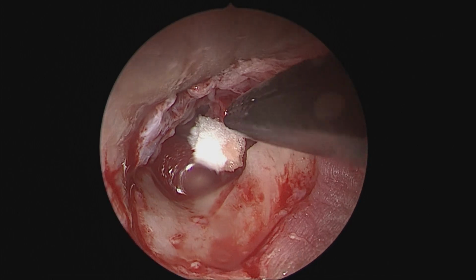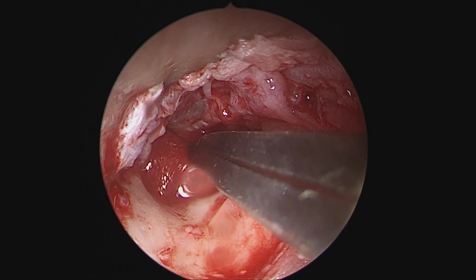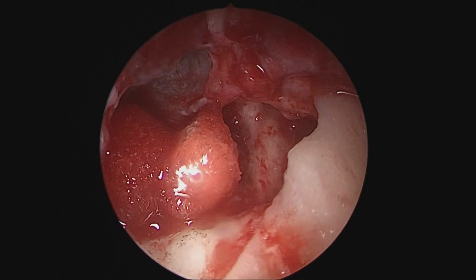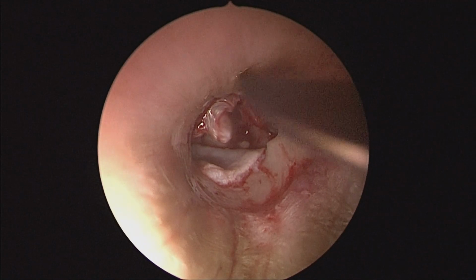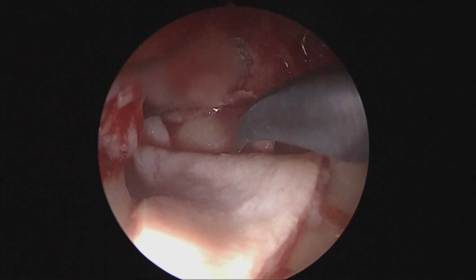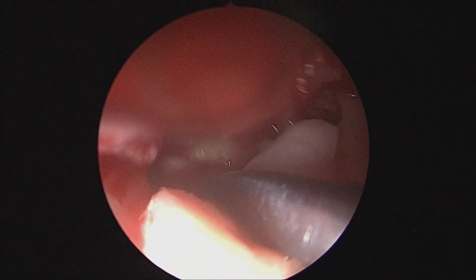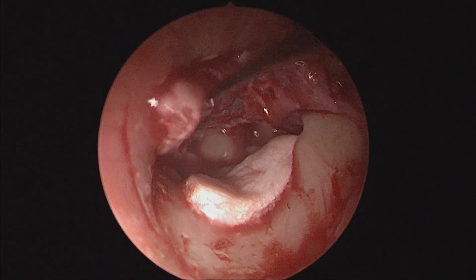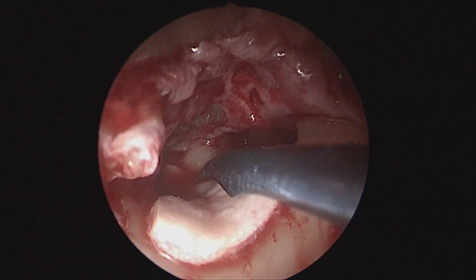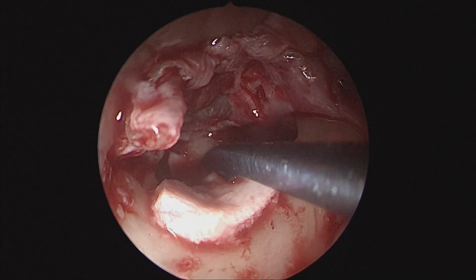So now as we prepare our cartilage graft, we would just put some small gel foam patties in the middle ear to achieve hemostasis while we initiate grafting. This is a small perichondrium that is taken from the tragus. So this we will be taking medial to the anterior tympanic membrane remnant.